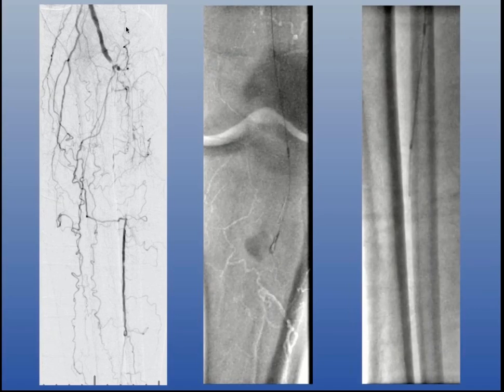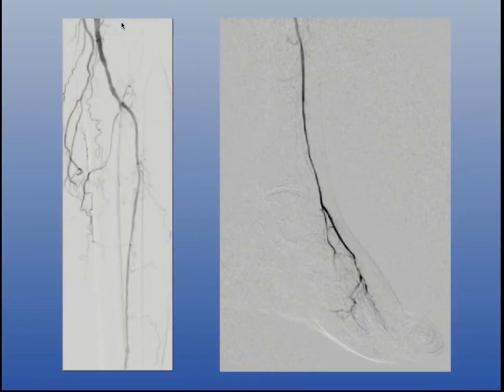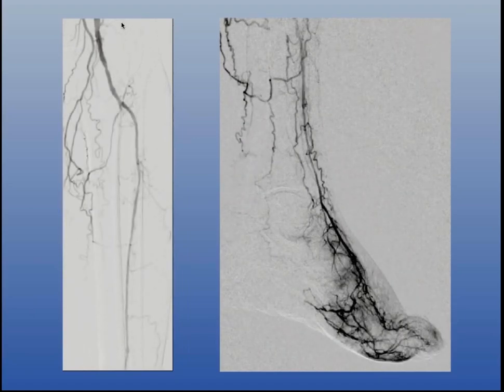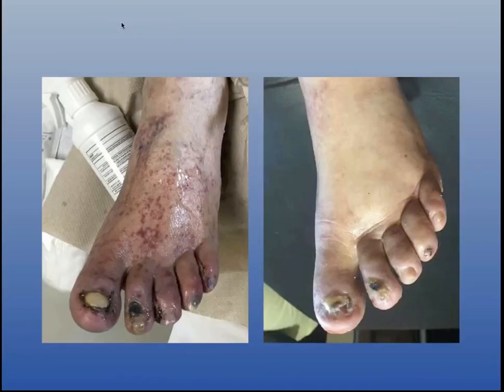On the far right, we're using basically a catheter and a penetrating technique to get through that proximal cap. And then I did an old technique, which is you just push the entire system through that CTO, and that's a feel thing. You're feeling that you're still in the vessel and following the course. So those are showing a bunch of the techniques we've already talked about, but the key is the knuckle wire technique in the middle. And then obviously, I did good vessel prep, did atherectomy, in this case orbital atherectomy, did a good prolonged angioplasty, low pressure, and then we had a nice angiographic result. And then this is what I showed you with that direct revascularization.